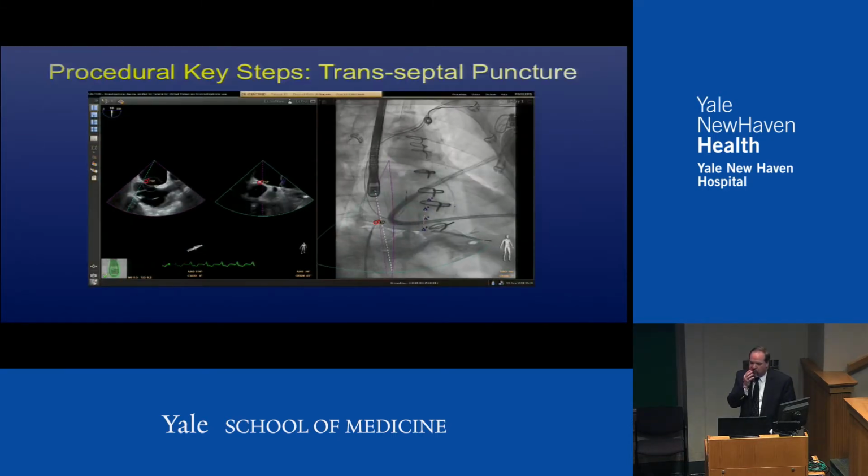So we'll kind of go through some of the first procedural steps. So this is one in which we're going to do a mitral clip.